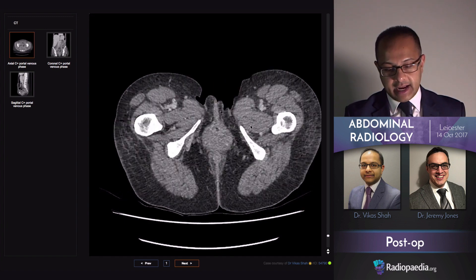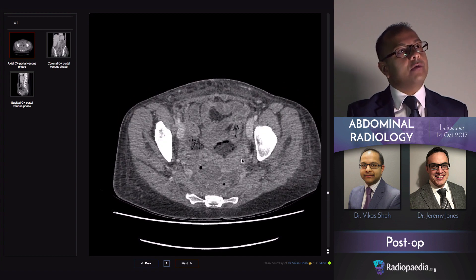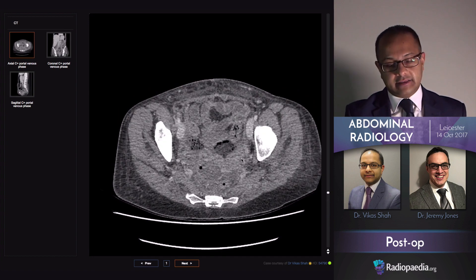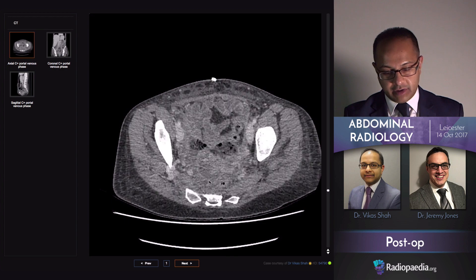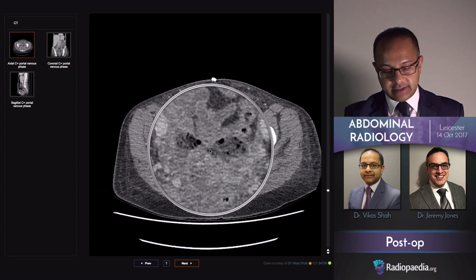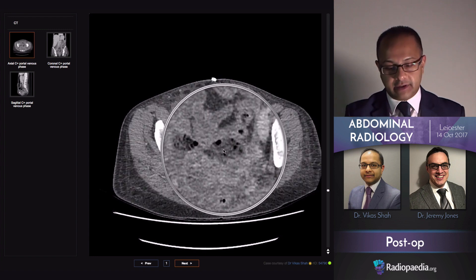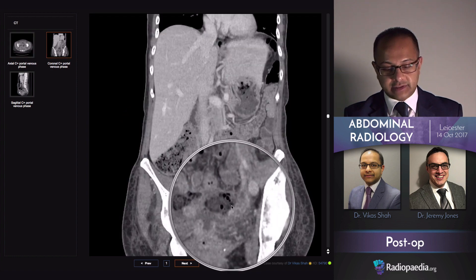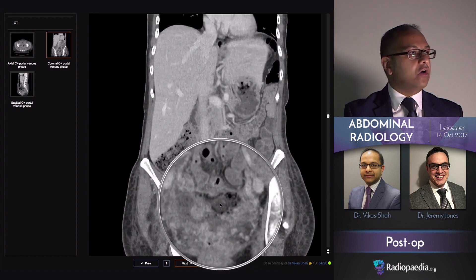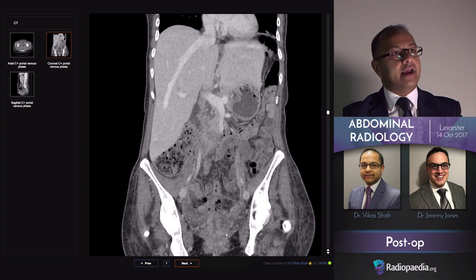This is someone who has had a hysterectomy. It was a difficult procedure with lots of intraoperative bleeding. They're having a scan afterwards and they have formed some collections here with fluid with enhancing margins. But this thing is slightly different — there's something wrapping above the top of the closed vaginal stump, which has got gas and soft tissue within it. And this was in fact a pack of Surgicel, which has been placed at the site of bleeding intraoperatively.